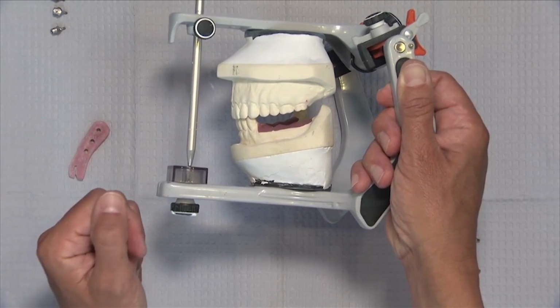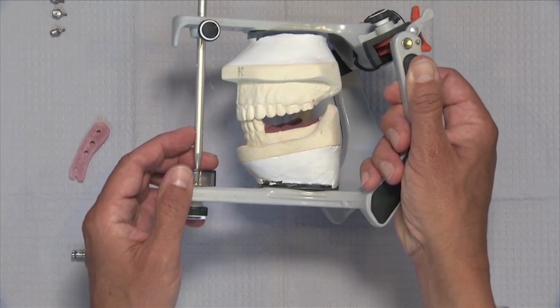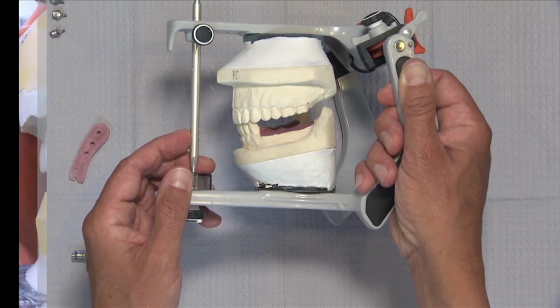We run into this problem in removable as well. Unfortunately, with implants, we can do things a little bit differently. So let's take a look at how we're going to use a positioning and bite index to solve this problem.